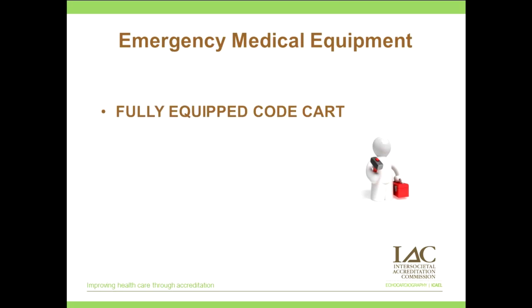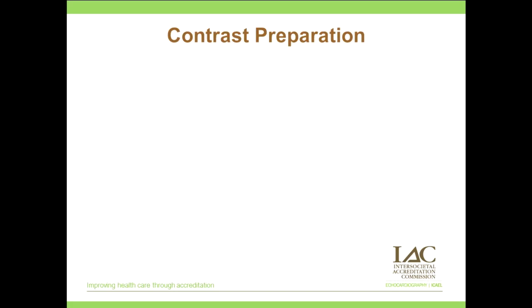Labs that use contrast will need a fully equipped code cart, including medication that treats allergic reactions, and you must also have trained personnel that are experienced in these conditions of hypersensitivity and potential resuscitation. So right now this is just going to be a brief overview on contrast preparation. And I want you to refer to the package insert and your application specialist. They should be one of your best friends. They're great to have out there. They're good for a detailed description.